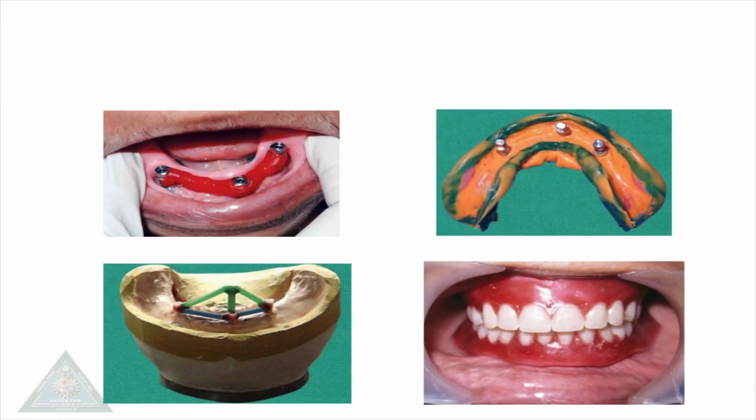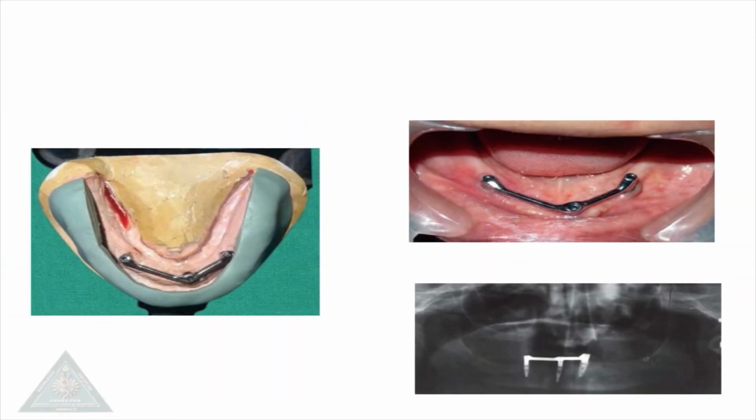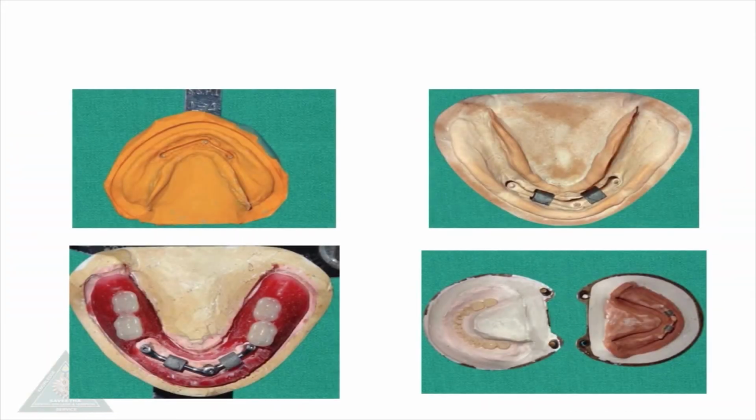And these are the examples of cases which have been done in our college, which is again a bar type and this is bar with the clip type.